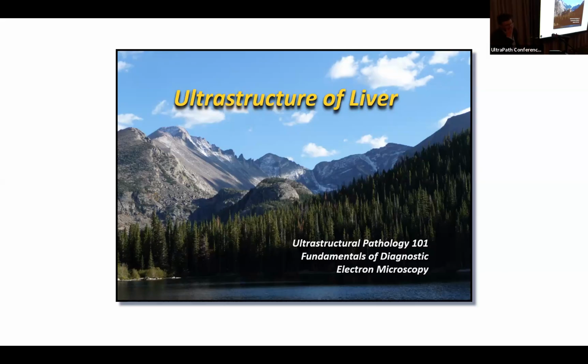Yeah. So now we're going to move on from the intro section to more organ-based presentations, and we're going to start with the liver.